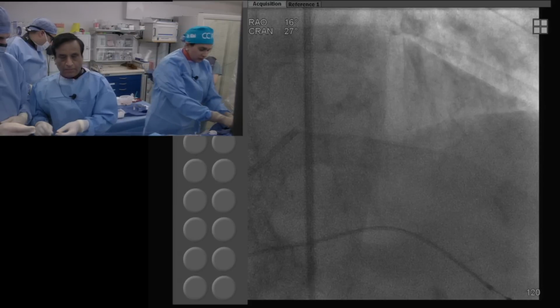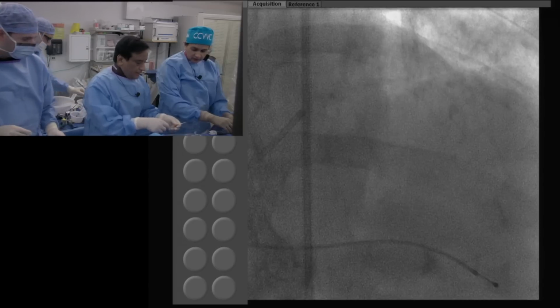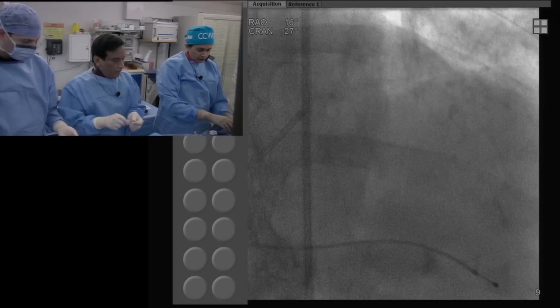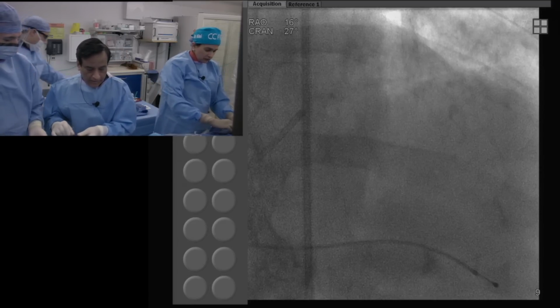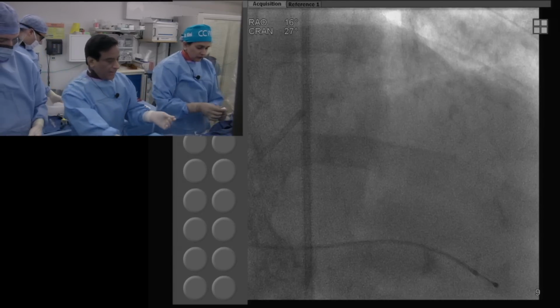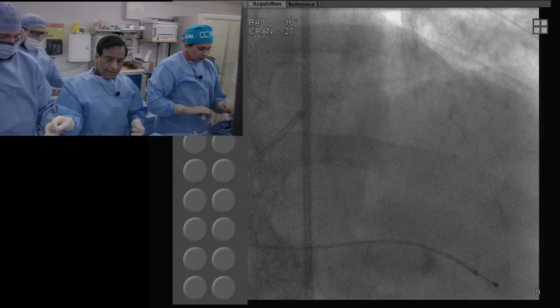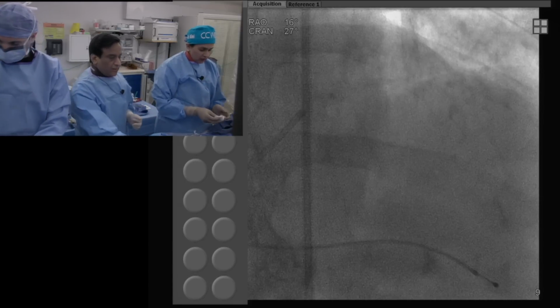Those were the cases, meaning complex coronary anatomy. Now this patient has a normal ejection fraction. They presented the data with the USpella registry that many of these patients do undergo hemodynamic deterioration, particularly when you use rotational devices. So maybe Impella is a good device for that. The FDA has now approved Impella for patients with a normal ejection fraction but with complex anatomy.